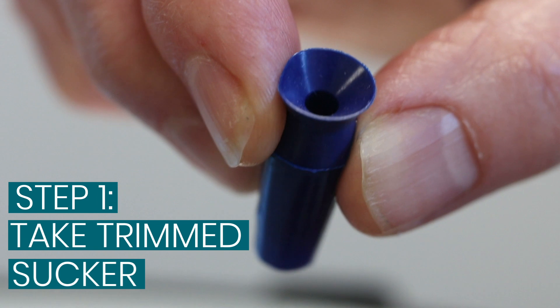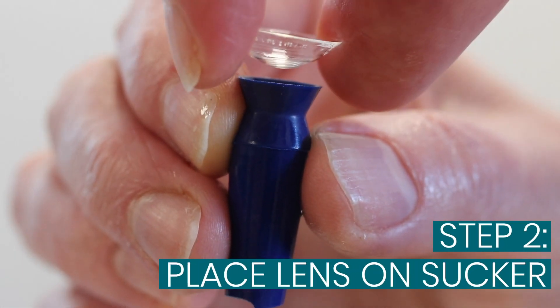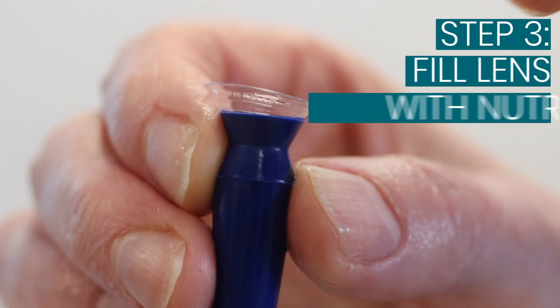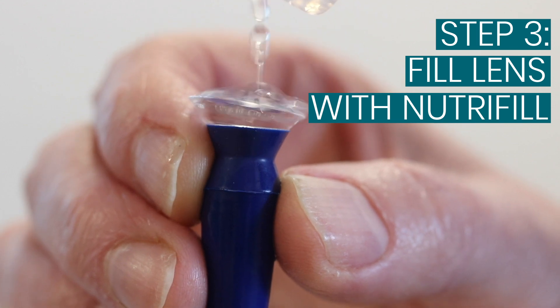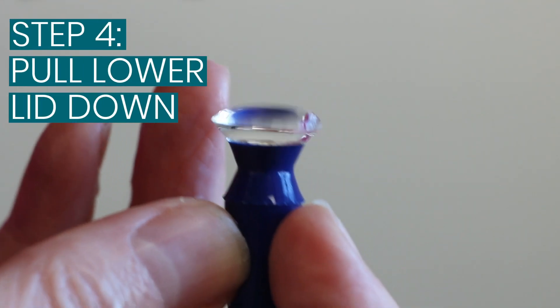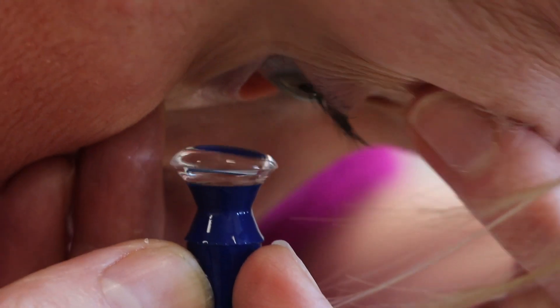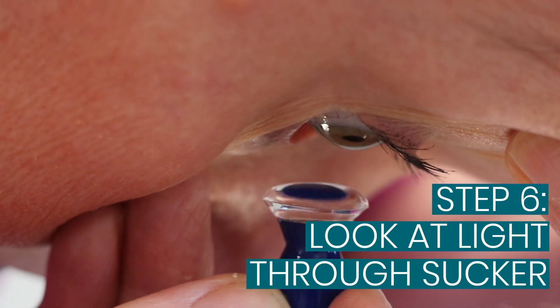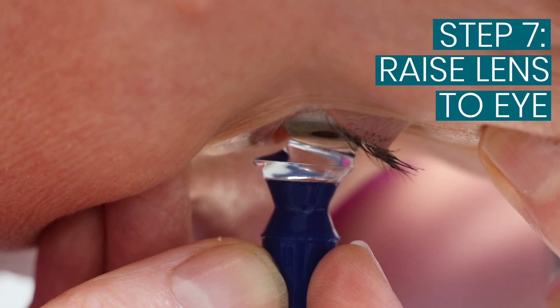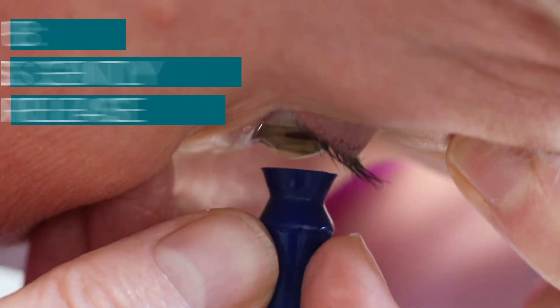With the trimmed sucker, the lens is simply placed onto the sucker, filled with the Nutrifill solution, and the process repeated. Finger on lower lid, other hand holds the top lid and gently lifted and pressed onto the eye. No need to release suction — just simply remove the sucker.